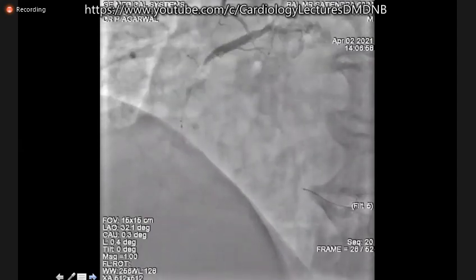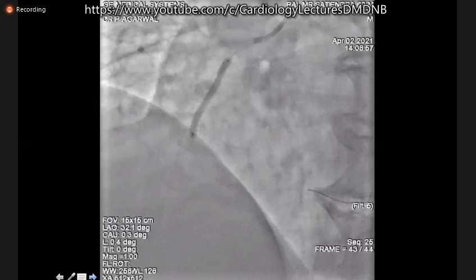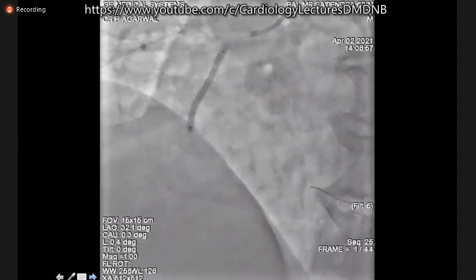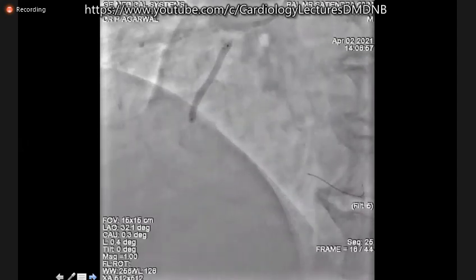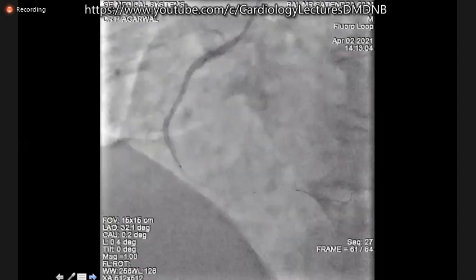Now it's a scaffold which is 3 x 32, deployed at about 14 atmospheres. And we can safely go higher because see, the marker is just 0.1 millimeter outside the scaffold. So safely you can go to slightly higher pressure than what is needed, right? Without having a danger of distal and proximal dissection. Now the OCT picture.